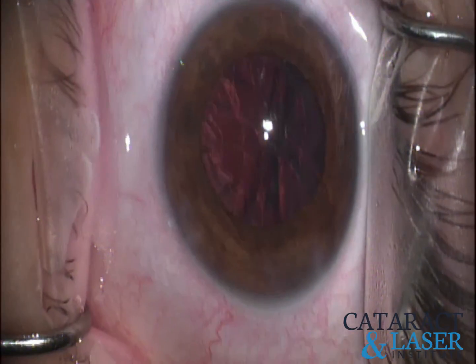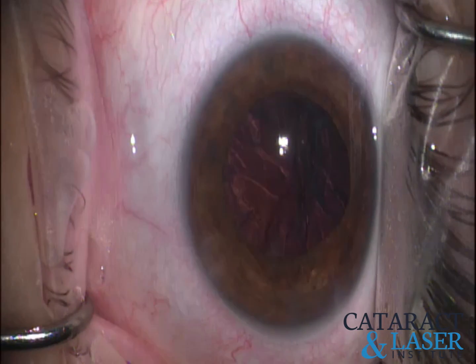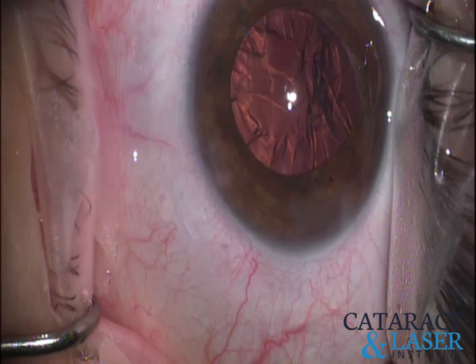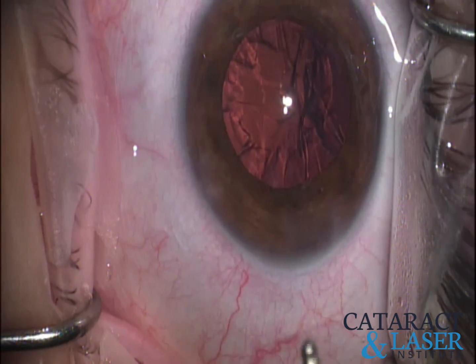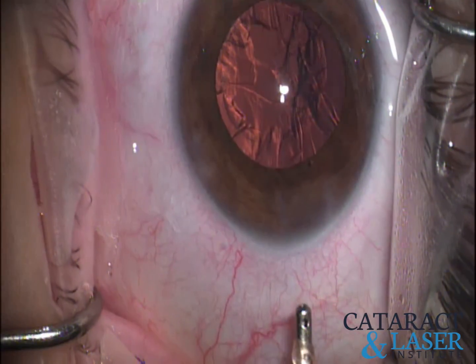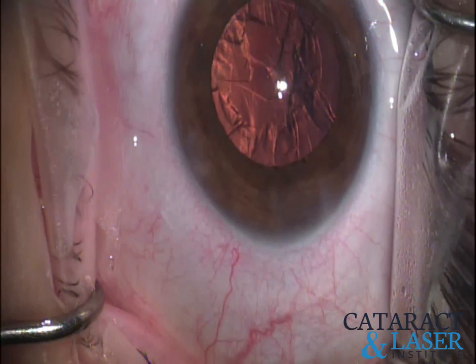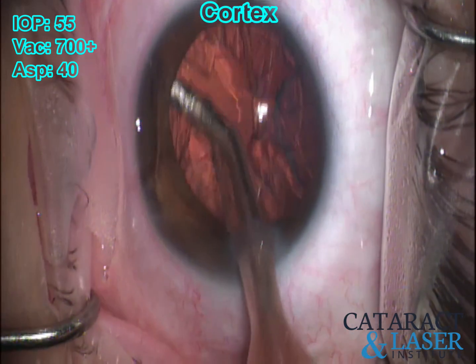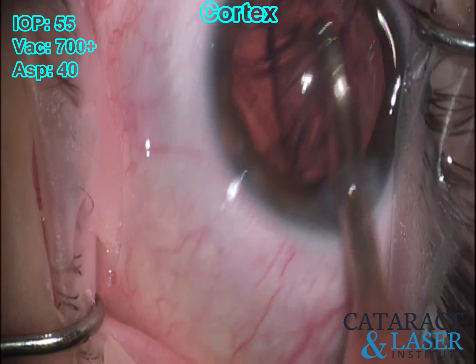The lens came out really nice. We're going to move on to the cortex. Sometimes these younger patients have a pretty sticky cortex — it really just depends on the person. Doing that extra hydrodissection at the beginning helps break the lens away and hopefully doesn't leave a lot of epinucleus behind, which can sometimes be a little bit of a pain to remove.